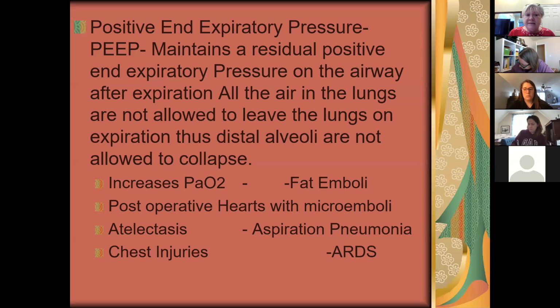So who needs this? People that are hypoxic need this, that need more gas exchange. And here's just some examples at the bottom of this slide for you. So we might use some PEEP for people who are hypoxic.